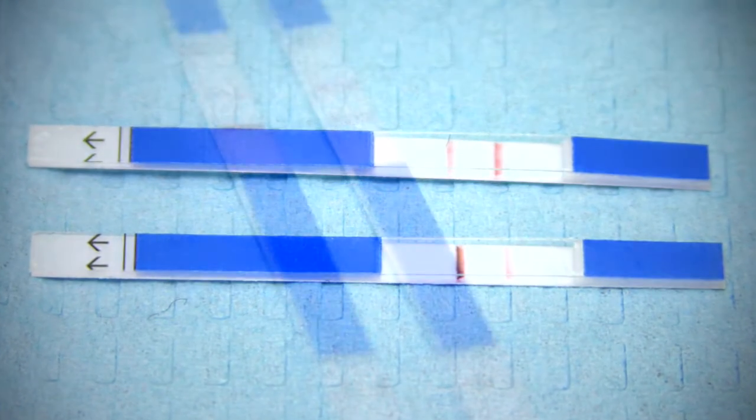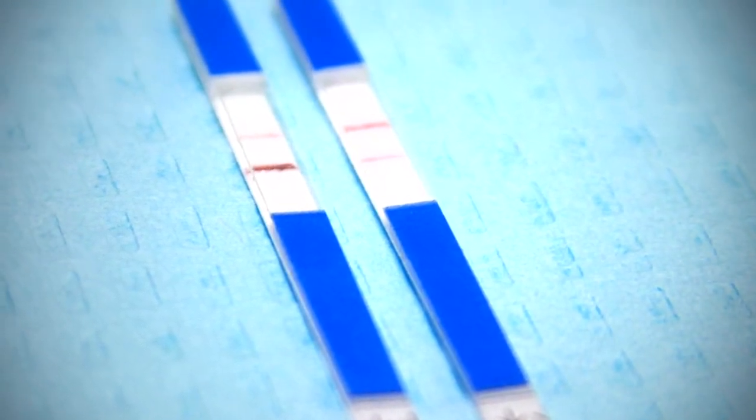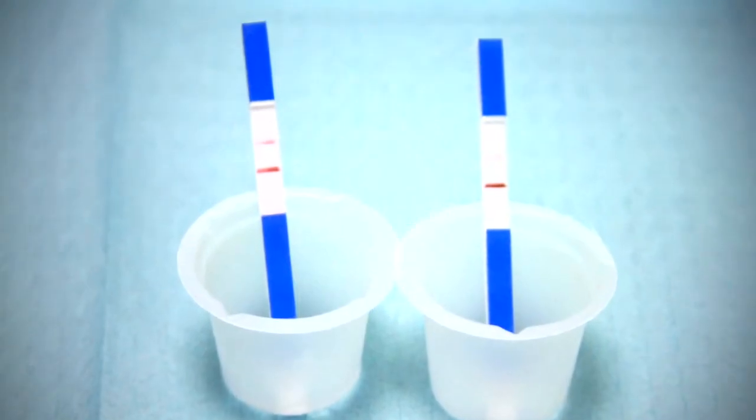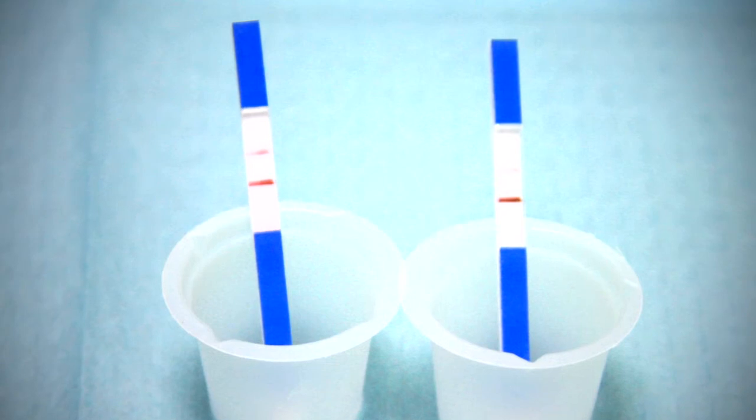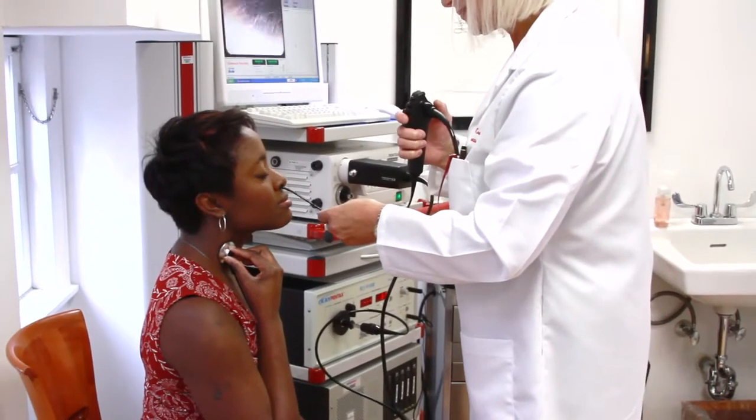Coffman's reflux test strips will test for GERD and LPR, also known as silent reflux. These test strips will revolutionize the diagnosis of reflux and help manage many reflux-related conditions. It will also help determine who should have esophagoscopy performed.